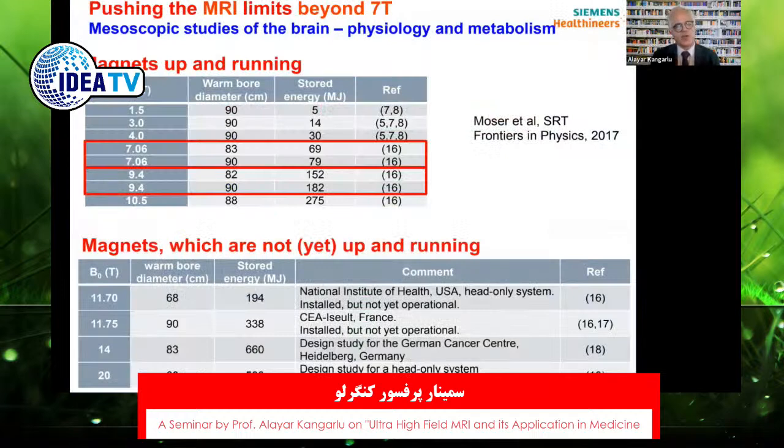The physics of MR is very important. A typical MRI scanner operating at 1.5 Tesla with a 90 centimeter bore holds a stored magnetic energy of about 5 megajoules. A 7 Tesla scanner, in comparison, holds a magnetic energy of about 70 to 80 megajoules.